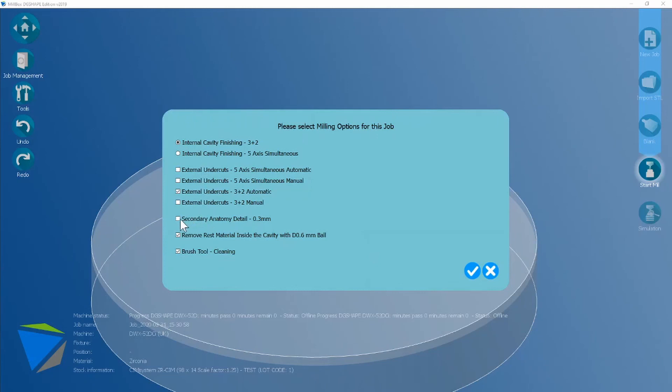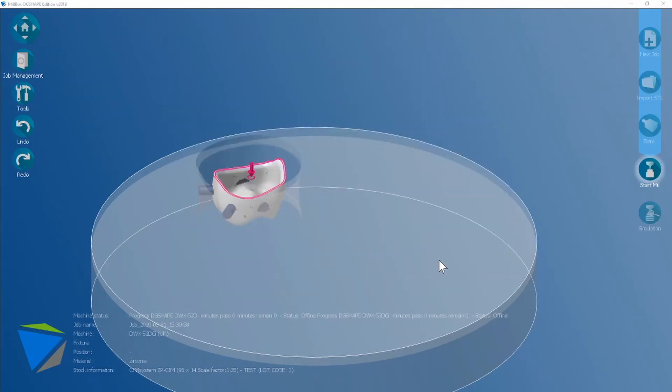I'm going to turn on the 0.3 anatomic detail and I'm going to use the rest milling inside the cavity and keep the brush tool on for zirconia. Once you're happy click next and the job will calculate.